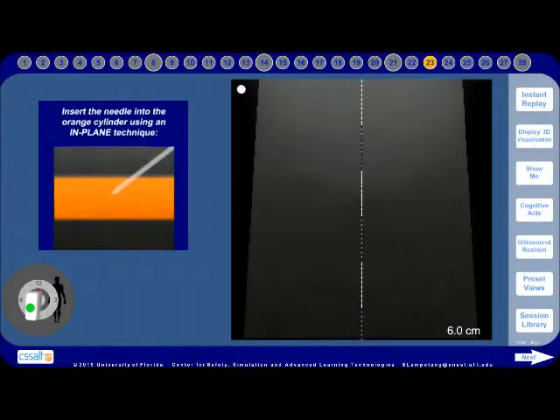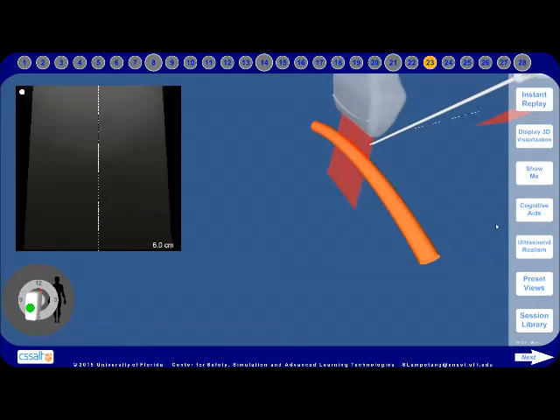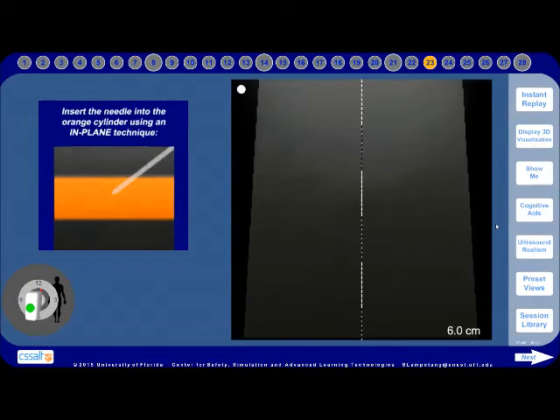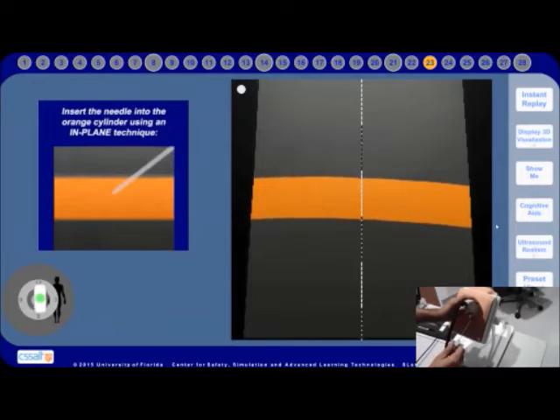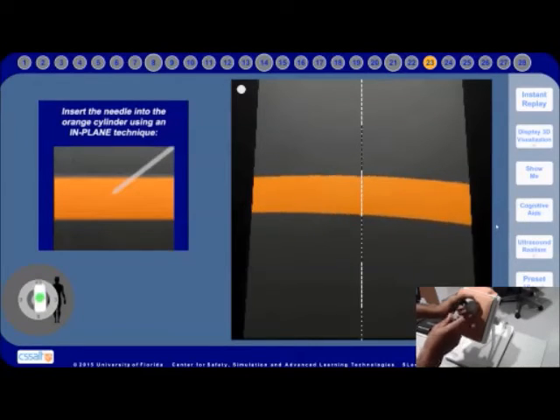The simulator includes a needle that is tracked in 3-dimensional space, in the same manner as the simulated ultrasound probe. Additionally, the needle is rendered in the ultrasound image. Therefore, in-plane and out-of-plane exercises can be practiced and demonstrated by the software. Additionally, needle anisotropy and unfavorable angle of incidence can be simulated if desired.